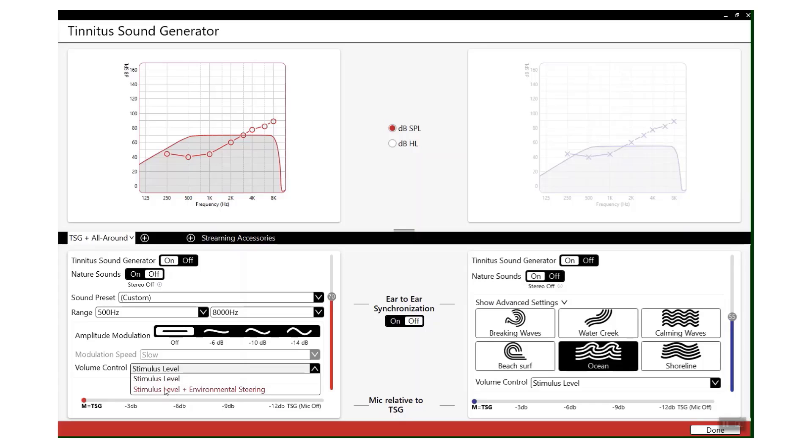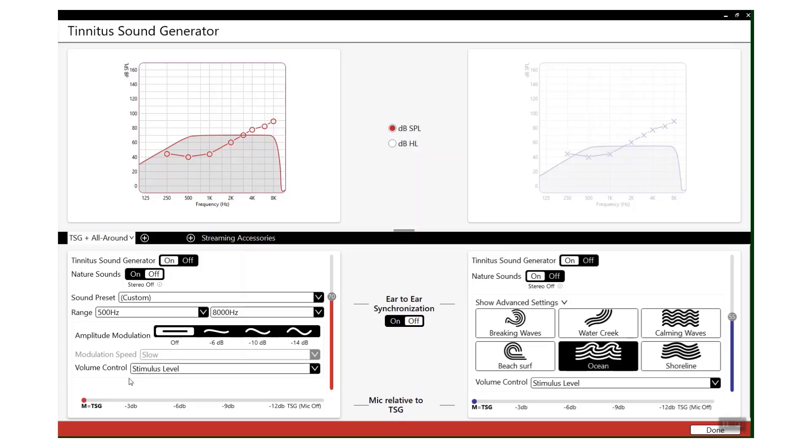Environmental steering is quite a handy feature, and what that basically means is when the patient goes into a more noisy environment, the tinnitus sound generator will automatically turn itself down because generally background noise will help to mask that tinnitus and they won't need that sound being played into the ear.